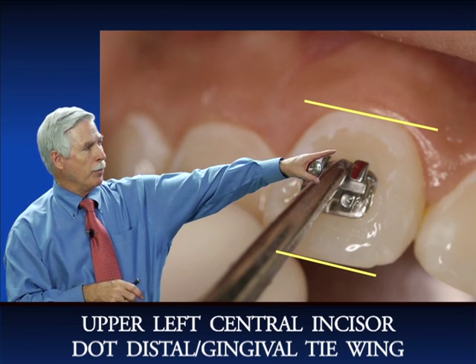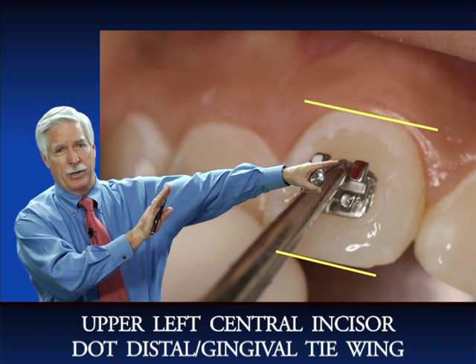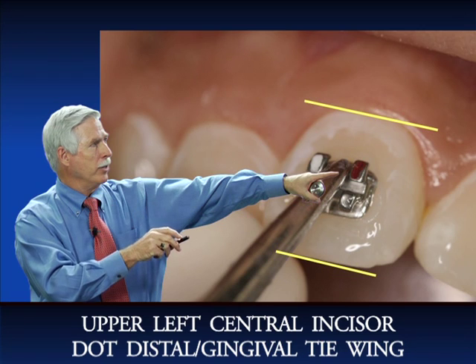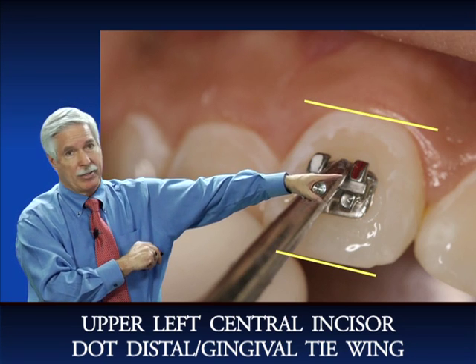Here you can see we're pushing against the tooth. We're pushing right against the tooth to make sure that the bonding material is tight against the tooth, and making sure we wipe off the excess around the edge. Again, the red dot shows that that's an upper left central incisor.